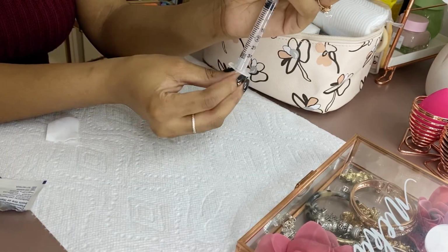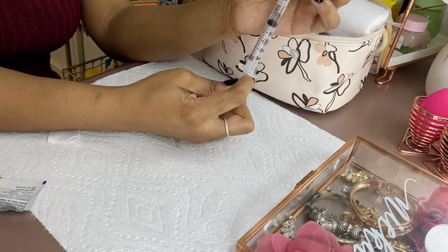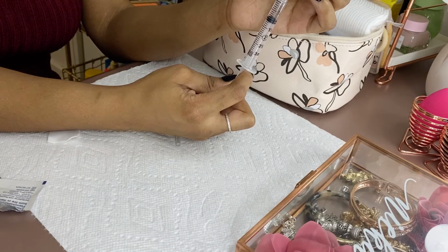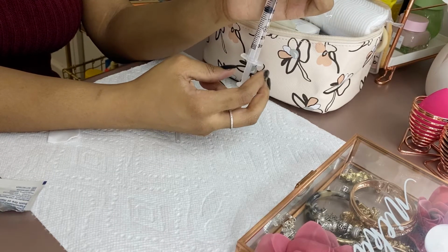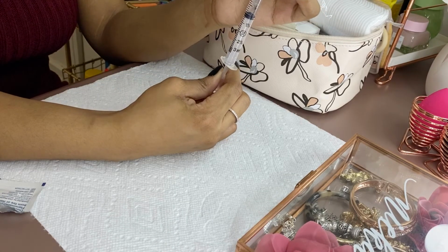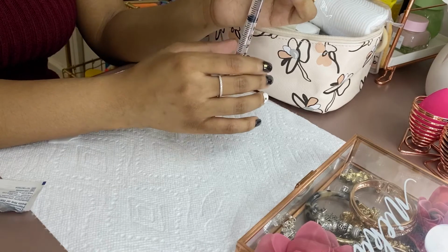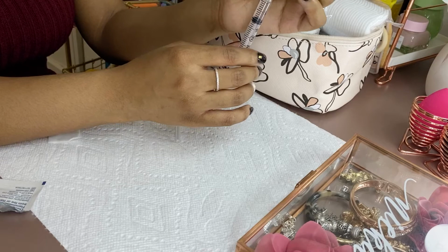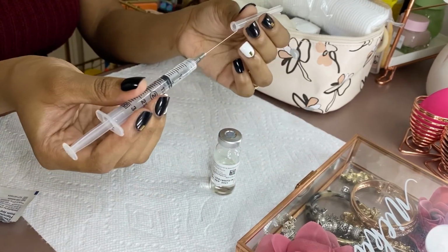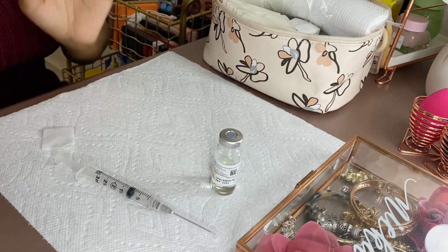This is a little awkward position. I usually don't do this in this direction, but I'm showing you guys because I can't see. You see the liquid filling up. Sometimes if you see it stop, it's because of an air bubble, so I push air back into the container and pull back again, and that's when it fills. You see I am filled to the line of 1 milliliter. Then I flip it upside down, take it back out, put my cover back on, and close it tight. I leave it there for whenever I am ready to inject.